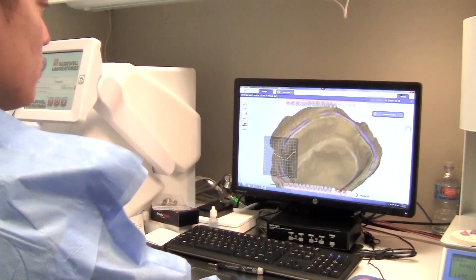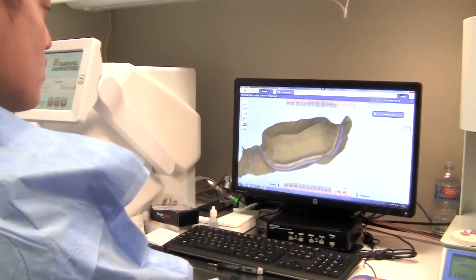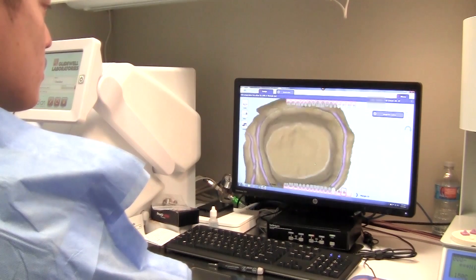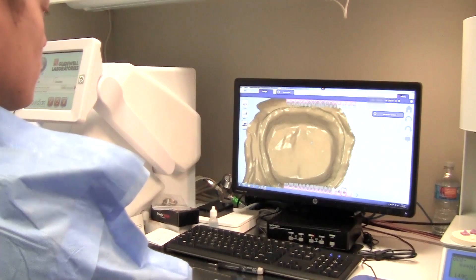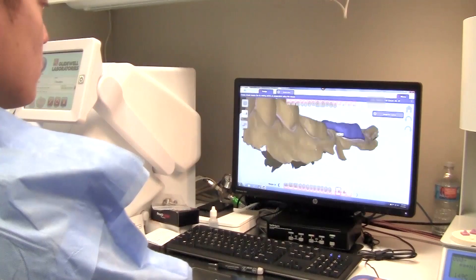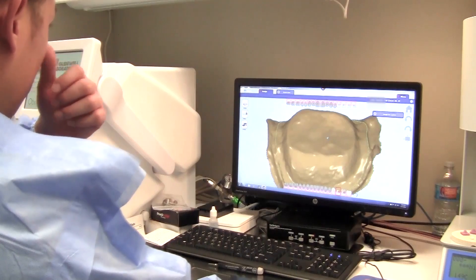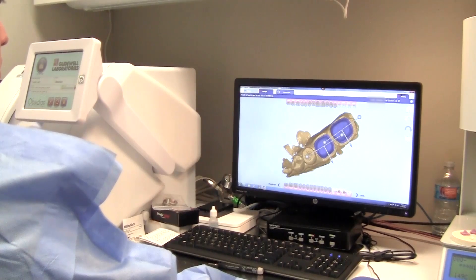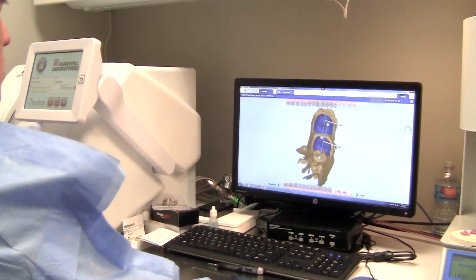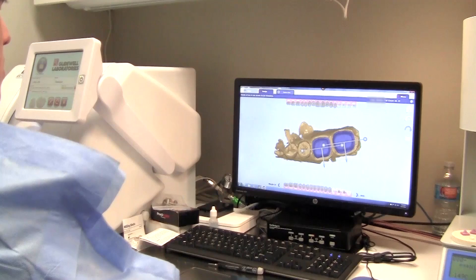Then it's time to mark the margins — and going back to proper tissue retraction, that's why it's so critical, because now it's up to you, or if you delegate to your assistant, to mark the margins and work the design. The software is very intuitive and easy to use. Once tissue retraction is done properly, you can see the margins very clearly. After the margins are placed, we indicate the buccal directions. The software isn't sure which direction is buccal, so you help guide that with arrows — an additional step, like the occlusal direction, to aid the software in positioning the design proposals.